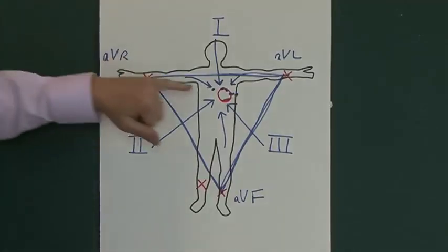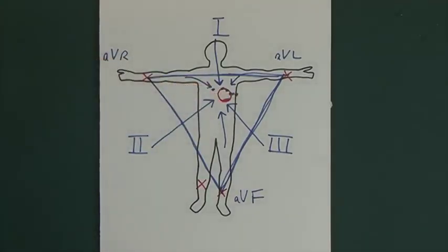If there's an anterior infarct over the front of the heart, that will most commonly be a thrombus in the left anterior descending artery, in the LAD. If there's a lateral infarct, that will tell us that the thrombus is most likely in the circumflex branch of the left coronary artery. But all this information is only available because the 12-lead ECG gives us anatomically accurate positioning information.